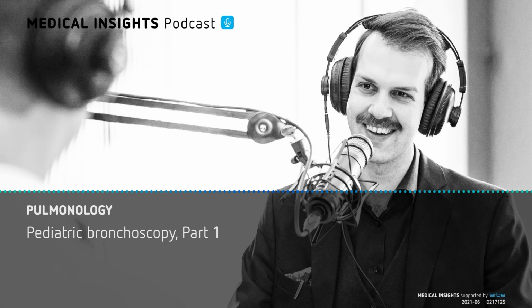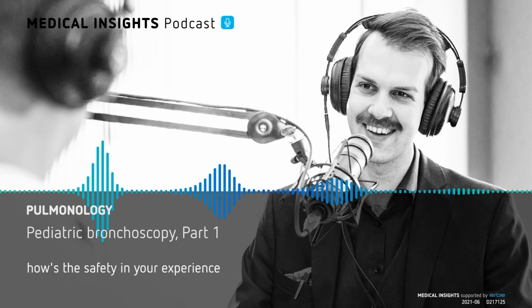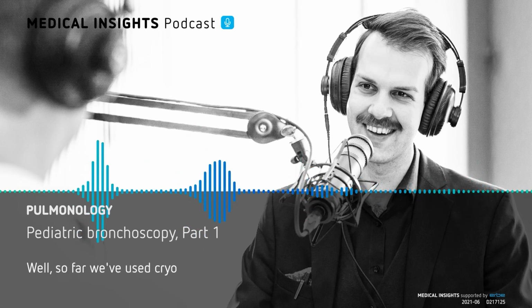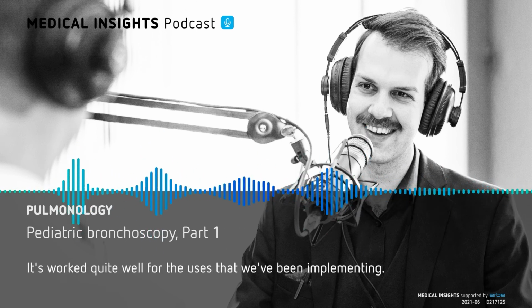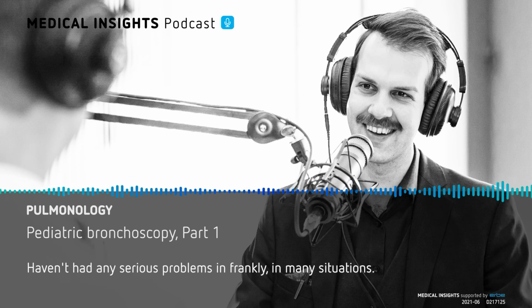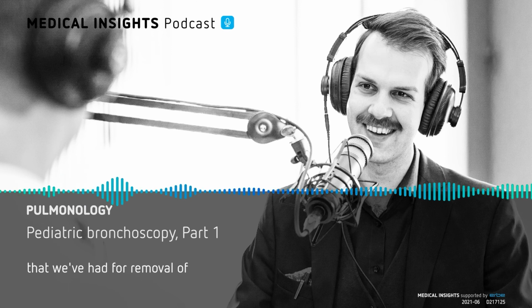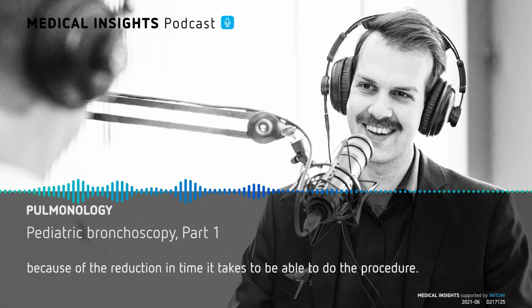cryo. Erik, one more question on the cryo extraction for me would be, how's the safety in your experience compared to the other approaches used? Well, so far we've used cryo with really not any significant complications in Cincinnati. It's worked quite well for the uses that we've been implementing. Haven't had any serious problems. And frankly, in many situations, I think it's been superior to a lot of the other options that we've had for removal of tissue or removal of clot or plugs because of the reduction in time it takes to do the procedure.